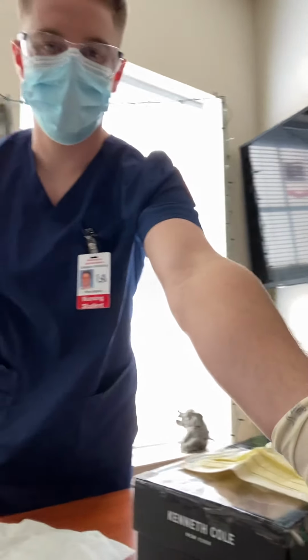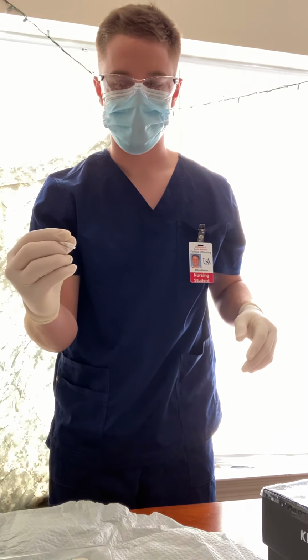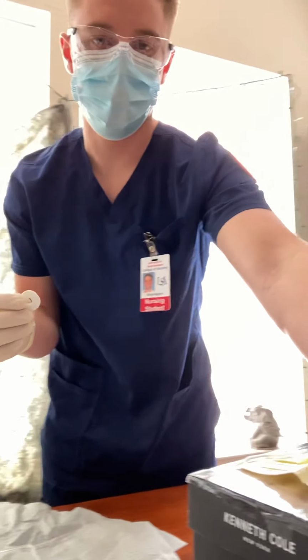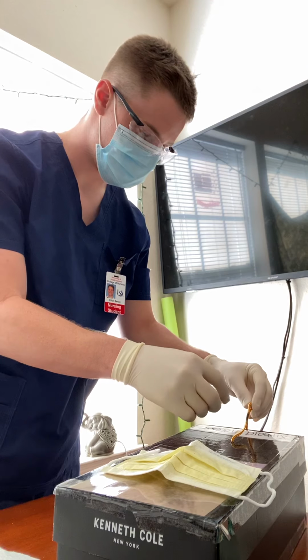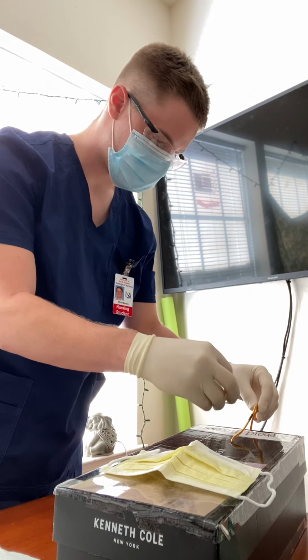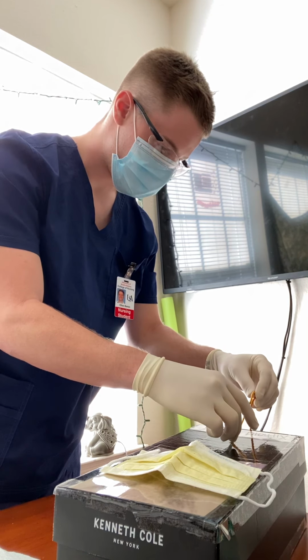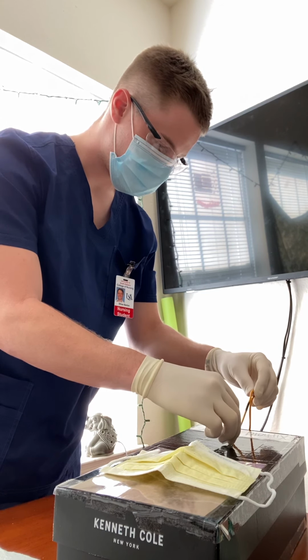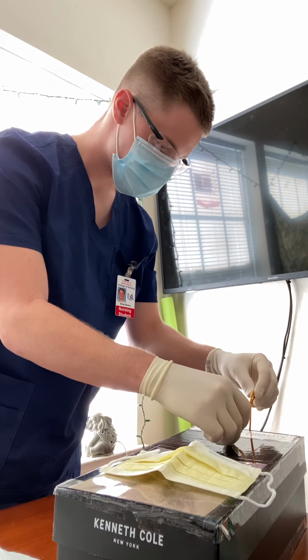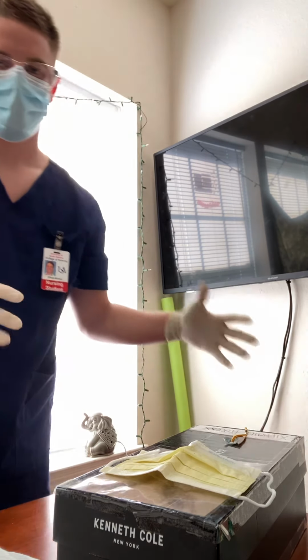I'm going to move the camera, break the sterility again. I have my bio patch. Then I'm going to move the camera once more. And I'm going to apply it with the blue side facing up. Once I've done that, I'm going to place it back down. And then now I'm going to break sterility again, turn the camera.